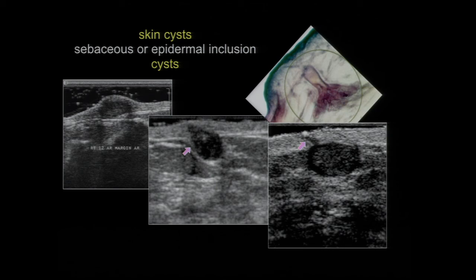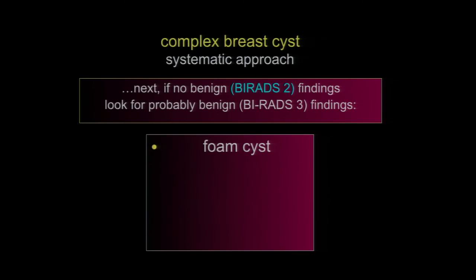Skin cysts are benign. They're sebaceous cysts or epidermal inclusion cysts, simply depending on whether there's been metaplasia in the fundus of the gland. They can be entirely within the skin, mostly subcutaneous with a claw of skin wrapping around them, or entirely subcutaneous with the gland neck and a white head or a black head obstructing it. These are definitively benign. Notice that I've required a standoff with a little heeling and toeing on each of these, especially here to show the obliquely oriented gland neck.